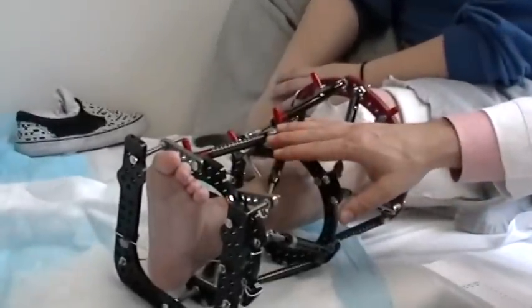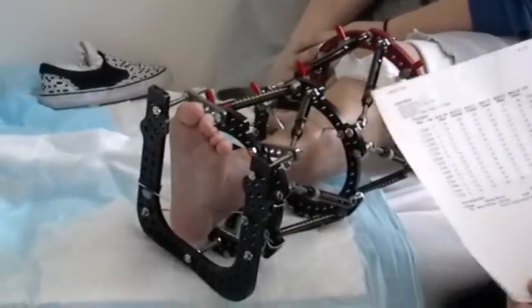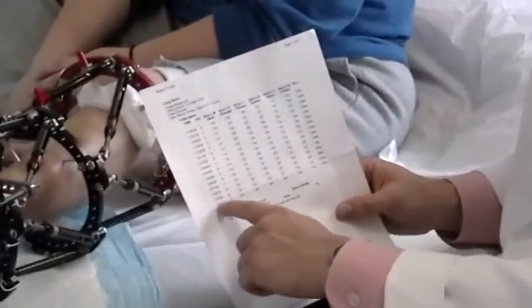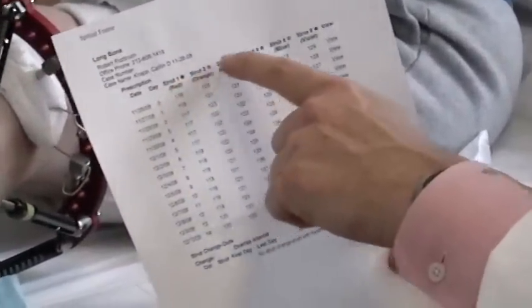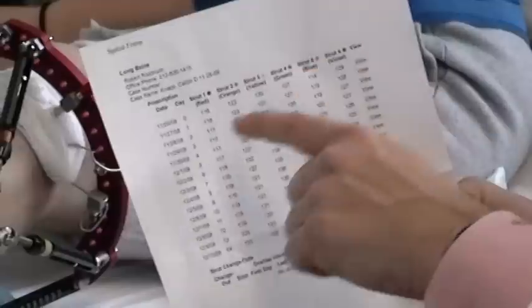We're going to show you how to make adjustments on this level right here. So this is what a schedule looks like — it's got the dates, the day number, and the struts: strut 1, 2, 3, 4, 5, and 6. They're color-coded red, orange, yellow, green, blue, and violet.